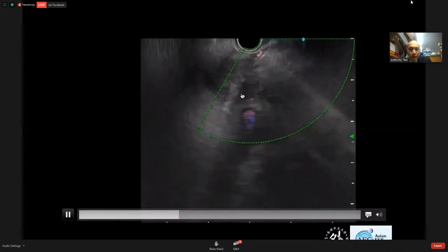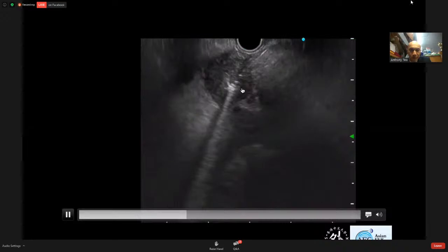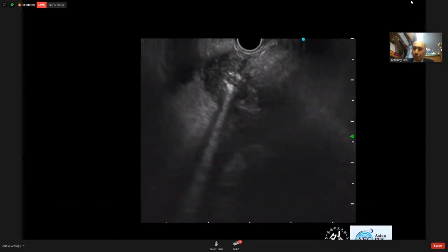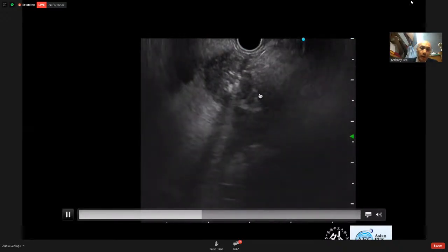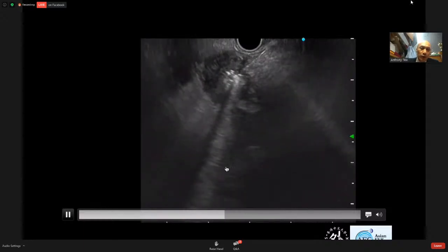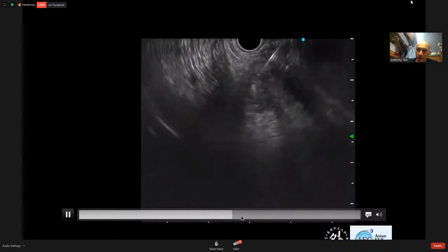And during radiofrequency ablation, you will see some bubbles coming up right there. So the needle is a needle with a water coolant in the tip. And it can be used to raise the temperature to 60 degrees for ablation. So multiple ablations can be performed along the track of the needle. And then if we need, we can repeat the ablation around the tumor as well.